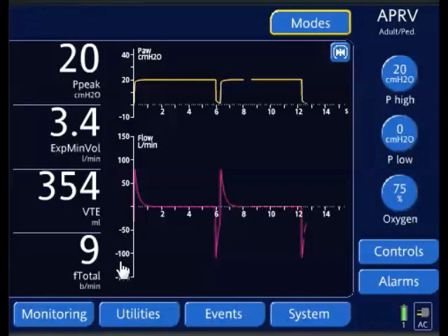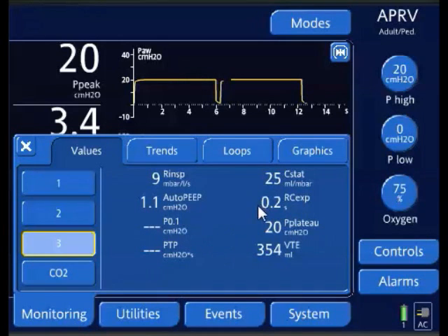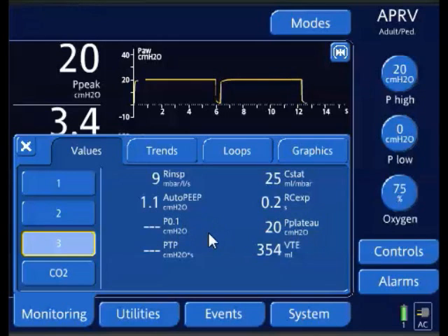We can actually calculate the expiratory time constant — if the ventilator does it, we can mathematically calculate it. Under monitoring, you can see here is my expiratory time constant. If a ventilator allows this measured value, you can find your measured value. So this is one time constant, and to make it four time constants, I just multiply this by four — that would be 0.8 seconds that we want our T-low set at for this technique.